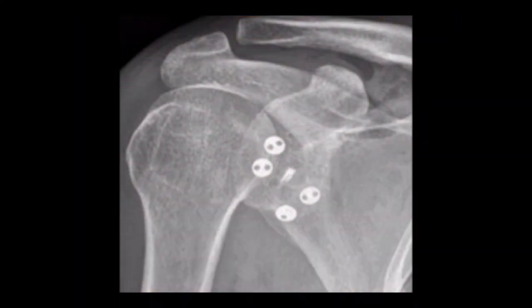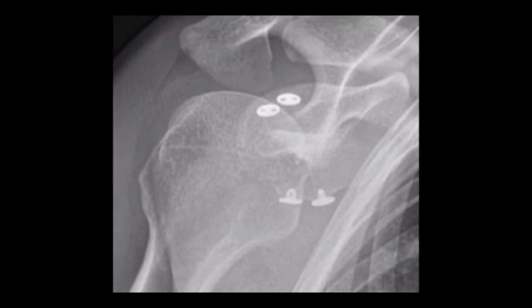Postoperative images show the graft nicely positioned in the inferior quadrant and evidence of an anchor from previous surgery.